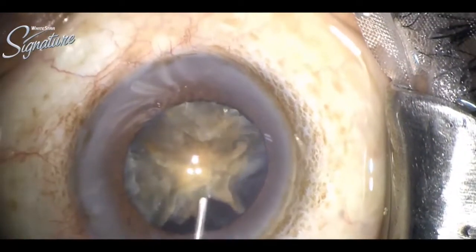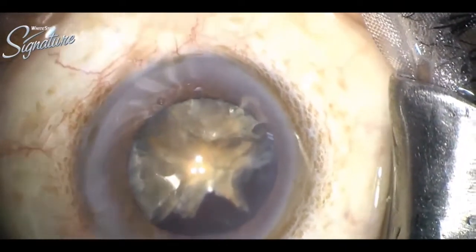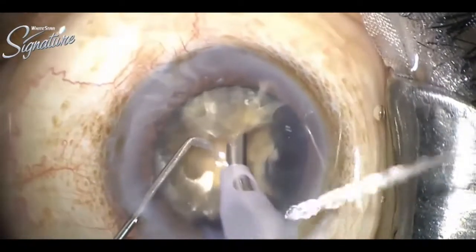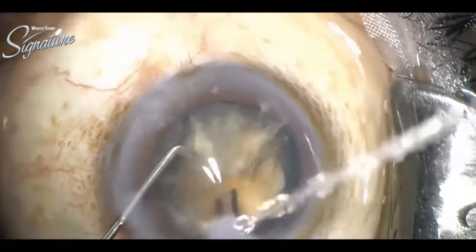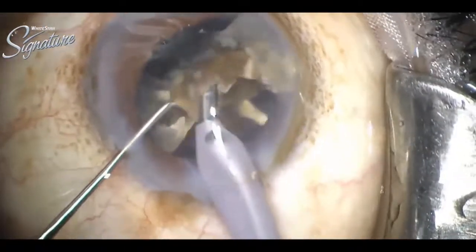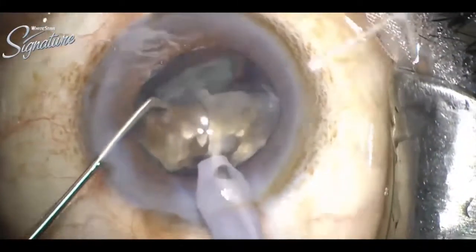There is no occlusion in this oval mode.